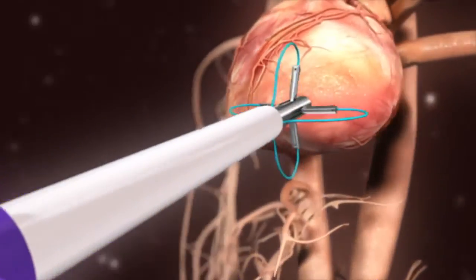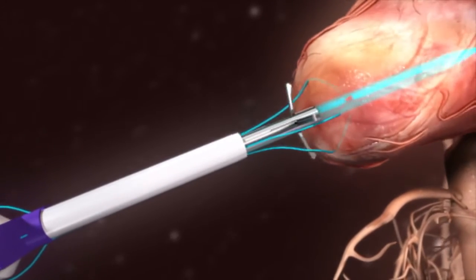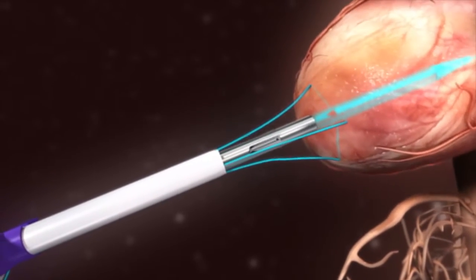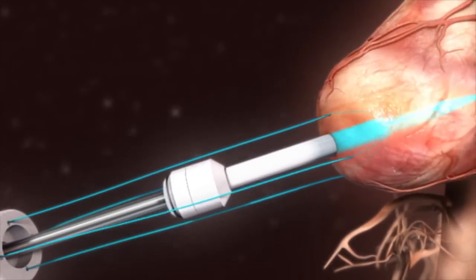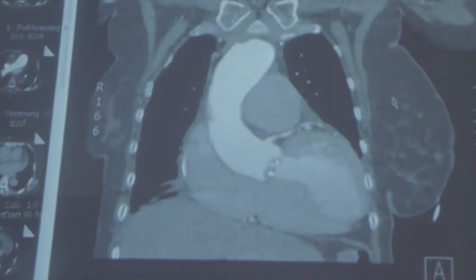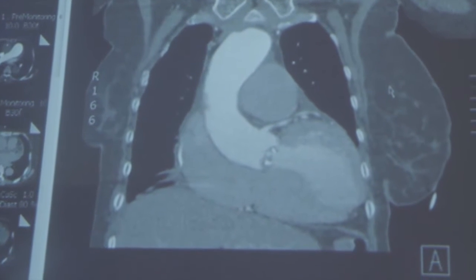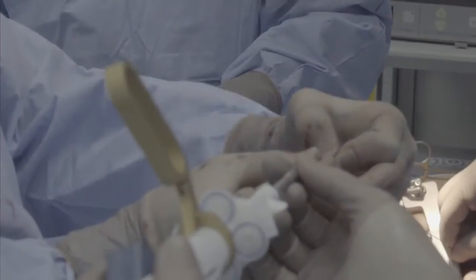As you see here, the device has been advanced into the apex of the heart, and two sutures on either side are pulled back, allowing them to come through the heart wall and be in place to tie and close at the end of the procedure. Then, a sheath is placed into the apex of the heart, which allows the physicians to enter into the heart and perform the valve implantation.